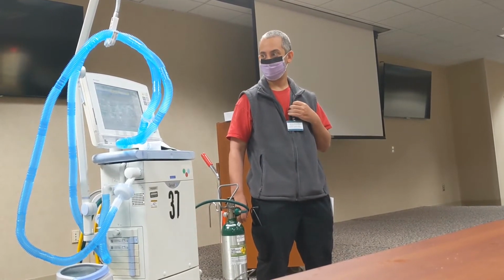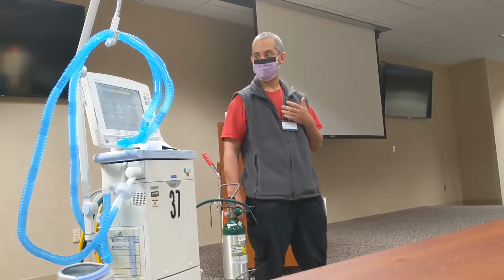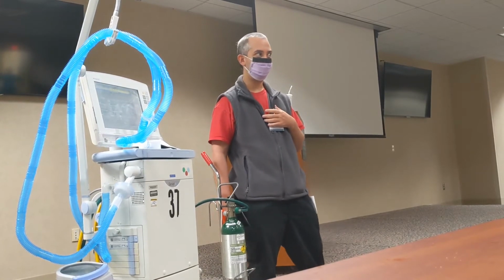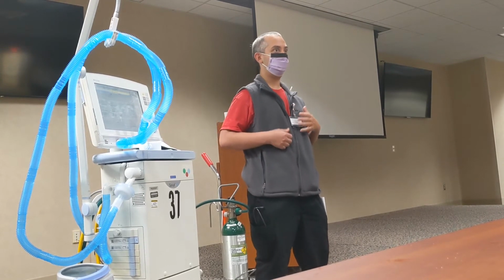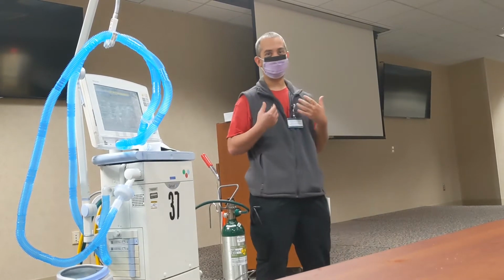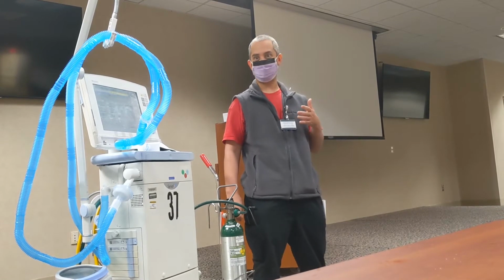And then one of the benefits that have been said with it is that it's actually a little bit more comfortable for the patient than you may think. You may think that, hey, I breathe in and hold my breath and then release and then breathe in really deep again, that may be uncomfortable.